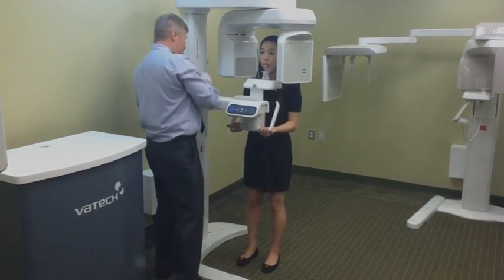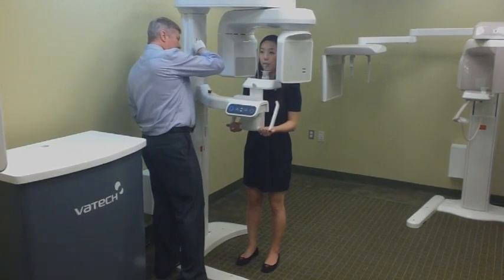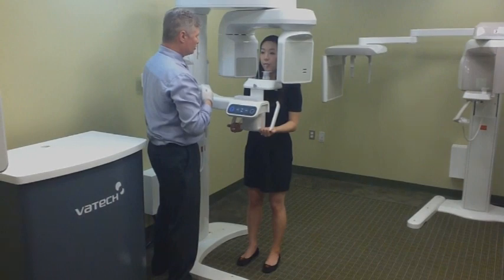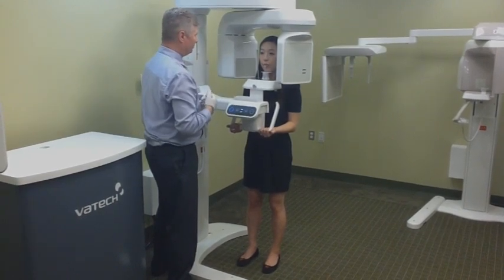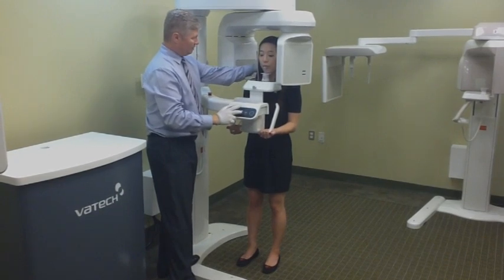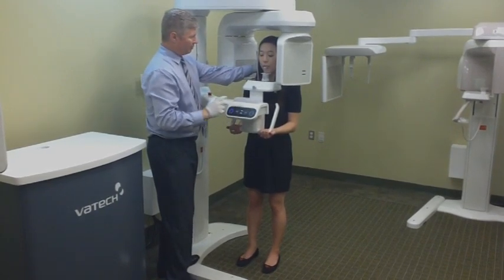So over here on my left, I'm going to bring it up to the top of your tragus right there. And I see it's almost down near the tip of your nose, which means I need to bring your chin down. Okay? So as I bring the machine down, I'm going to place a couple of fingers behind the back of your head here and just kind of slightly push forward there.